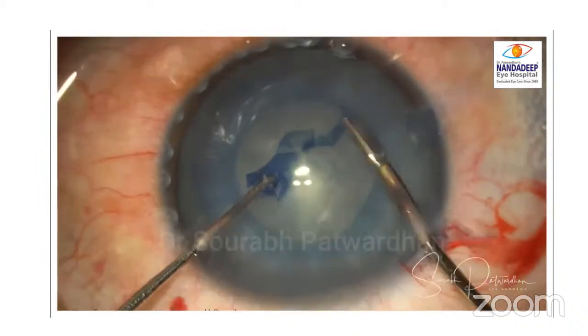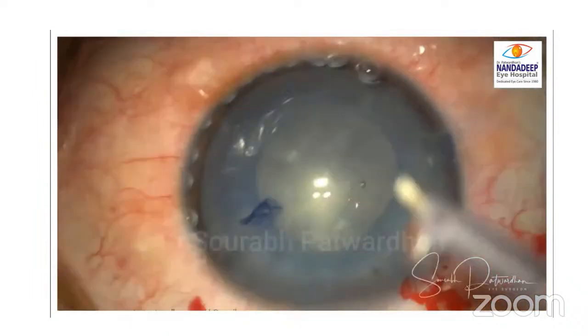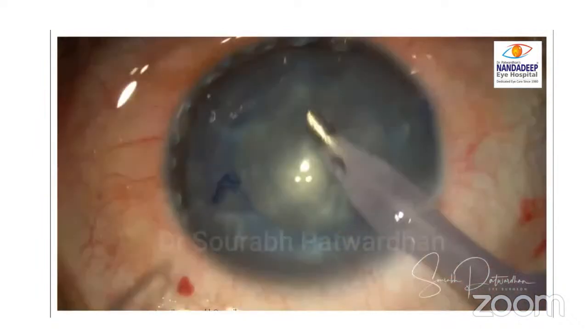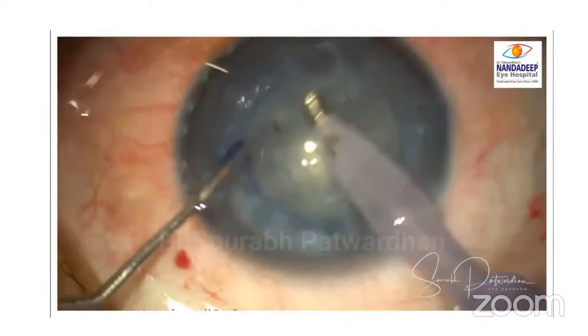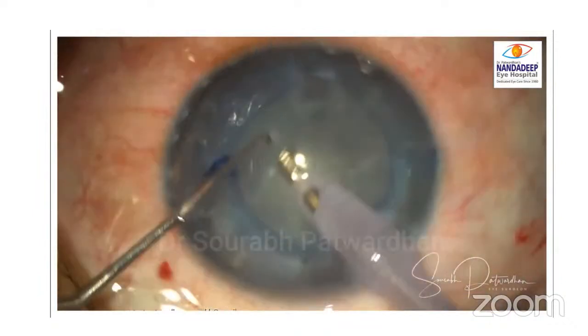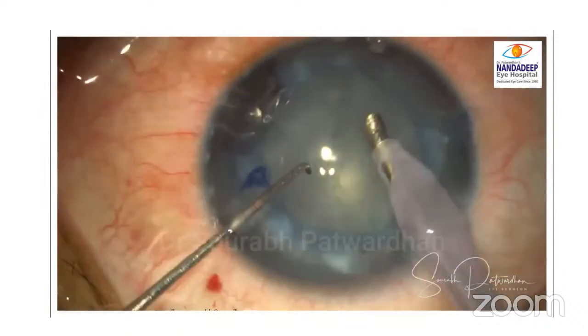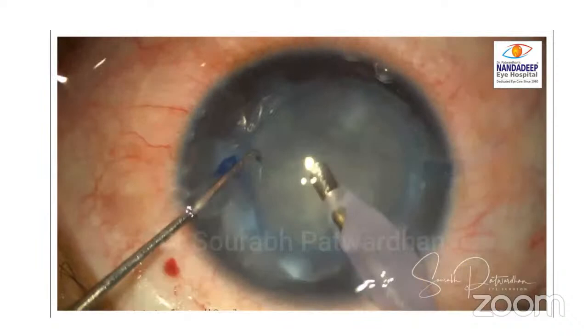So this is the best way to do it from the side incision, and just for the last bit I use the micro capsulorhexis forceps through the main incision, making sure there is no leakage of viscoat from the main incision. I didn't do any hydrodissection here, and because this is a soft cataract, I just want to aspirate it out.